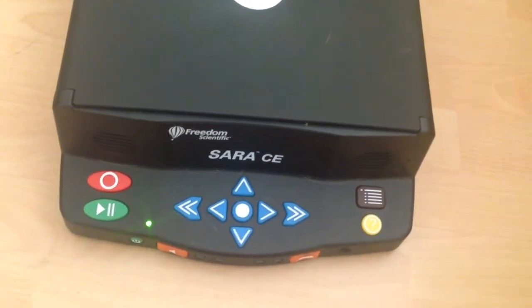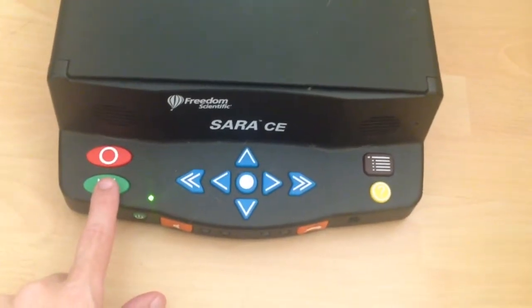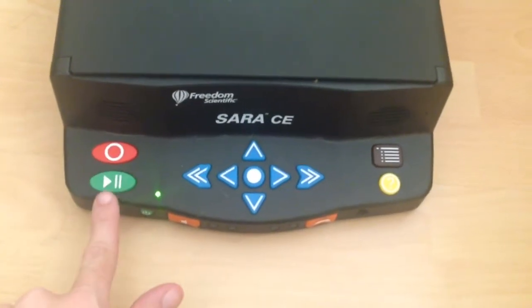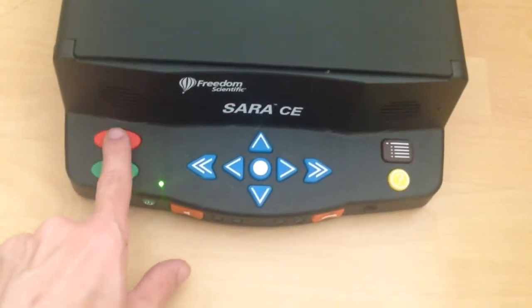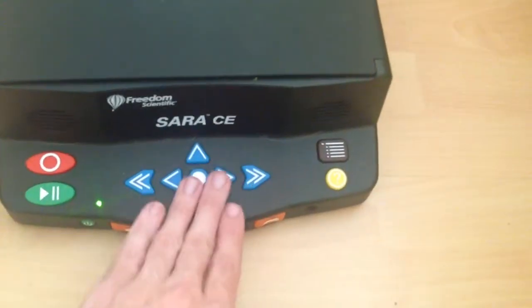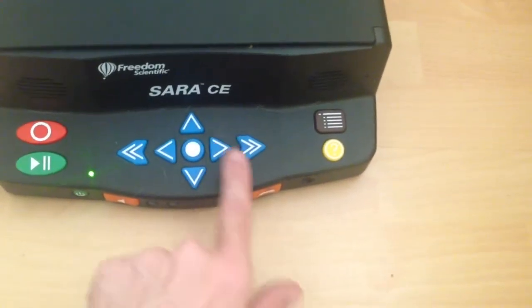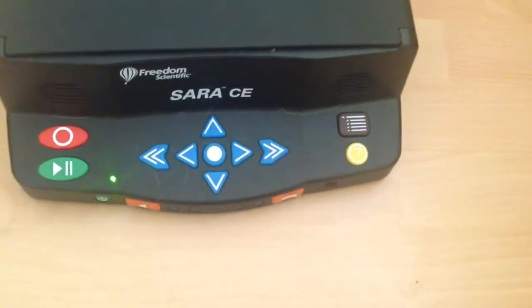Welcome to SARA. Serena is the current reading voice. Press the Read key — located directly below the Scan key — to begin reading. Press the Help key — located at the bottom right of the keypad — followed by any key to learn what it does. New document: place a page under the camera. The Read key is bottom-left, the Help key is bottom-right, the Scan key is the circle, and the Select key is the centre circle with arrows for moving by line, sentence, and paragraph.